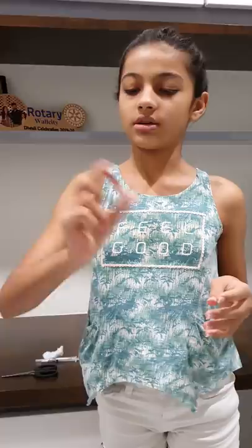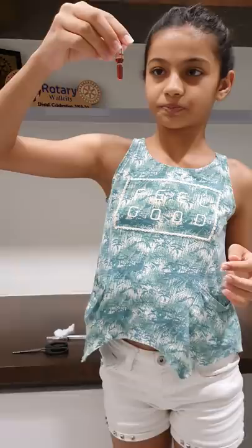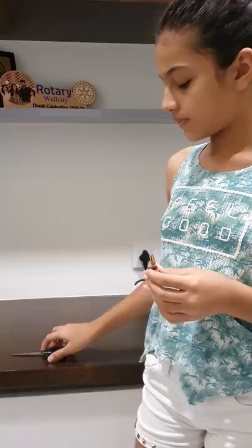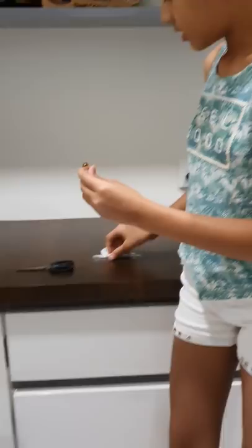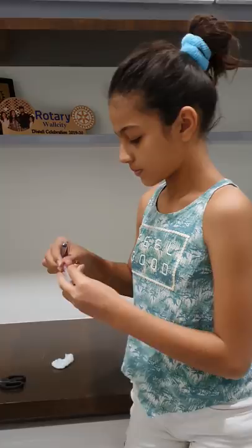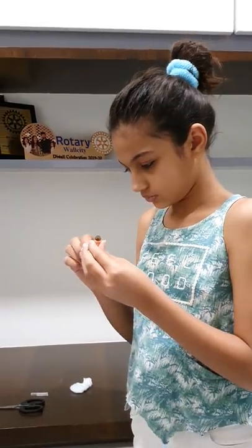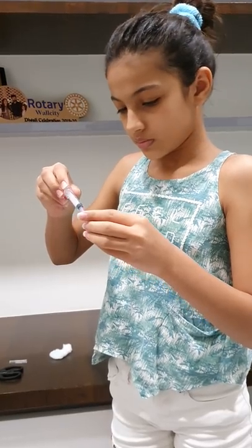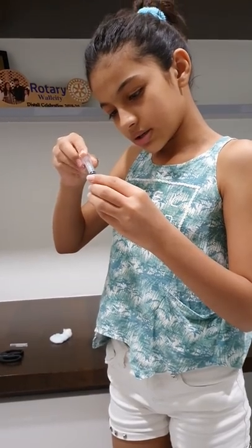First, we are going to shake it well and then keep it upside down for a while, and then we are going to cut it. Then open your syringe and take all the medicine into it.